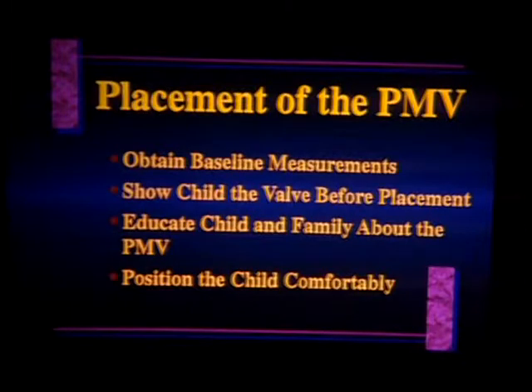So the other pieces of placement with the Passy-Muir valve: now I'm going to do an actual placement, and we'll go through some of the things that you want to consider as you're doing a placement in pediatrics. Obtain your baseline measurements. Get your saturation just as you would. In kids, sometimes we don't allow the saturation to drift down, maybe to 92 as a cutoff, but really consider what your facility's norms are for kids. It varies in different places throughout the country, but you may want to consider keeping the saturation above 92. It really varies though.